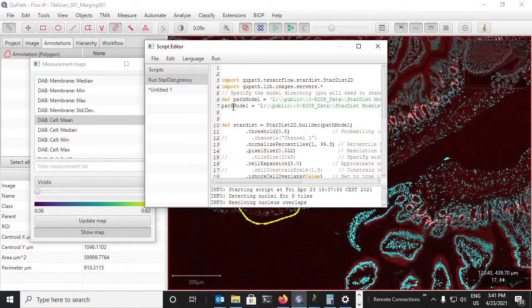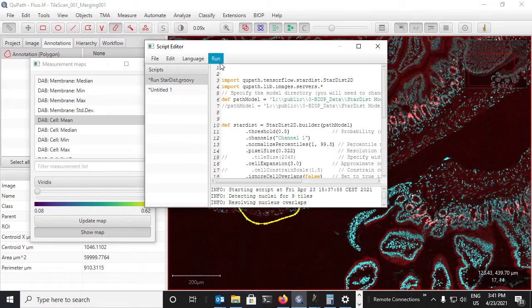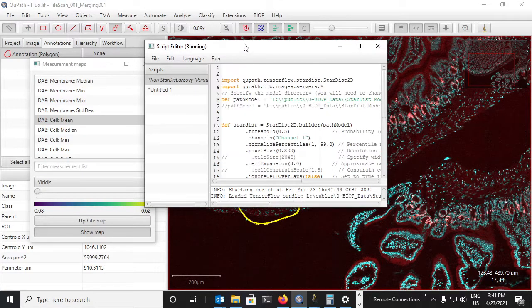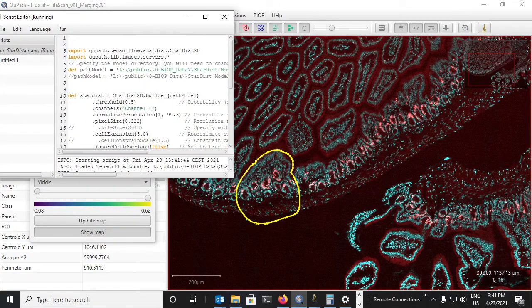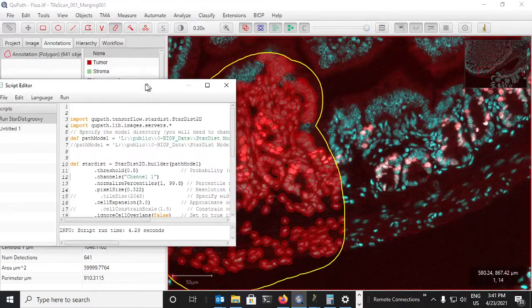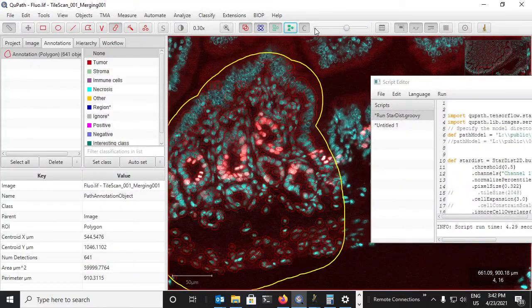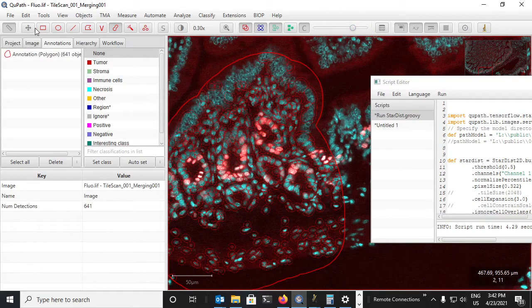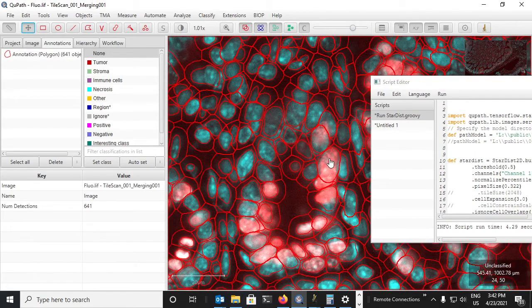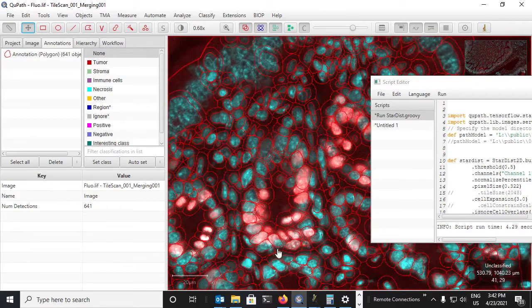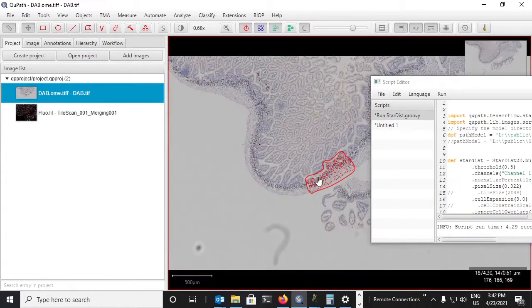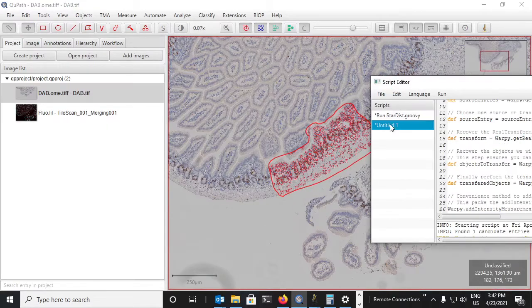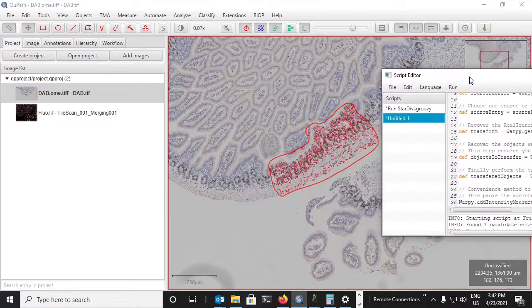Here I'm modifying the script so that it will work on fluorescence. Here the cells have been detected and now what we want to do is transfer these detections back onto the DAB image. So I'll save these changes here.